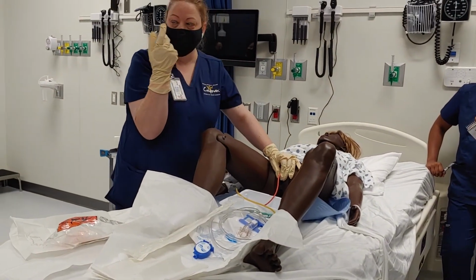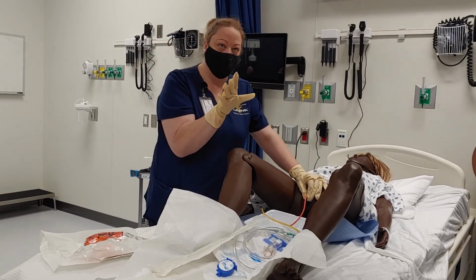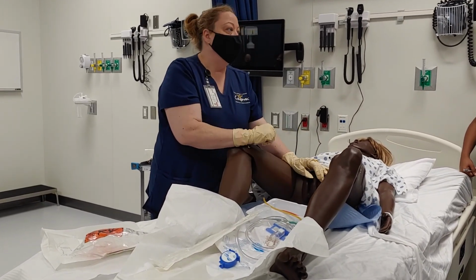But there's no inserting the fluid to make a balloon, okay? This is not an indwelling. This is just a straight cath. As soon as we're finished, we take it right back out, clean them up.